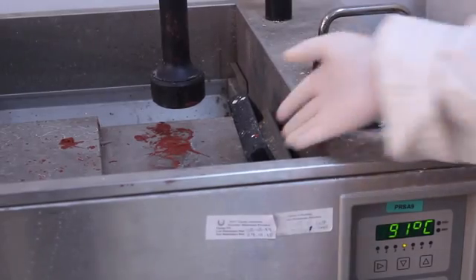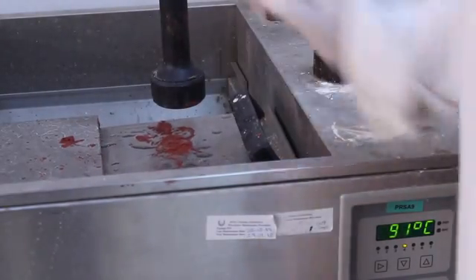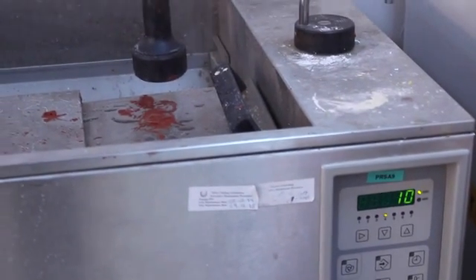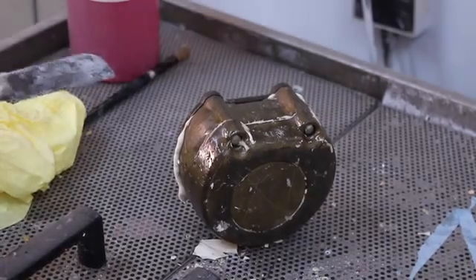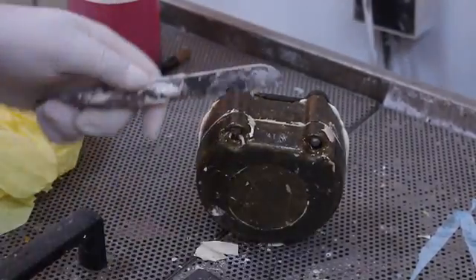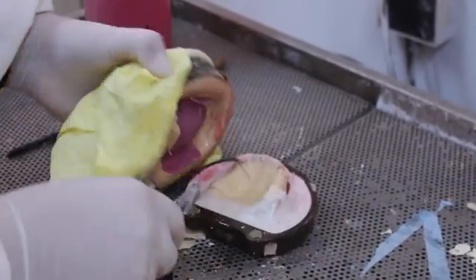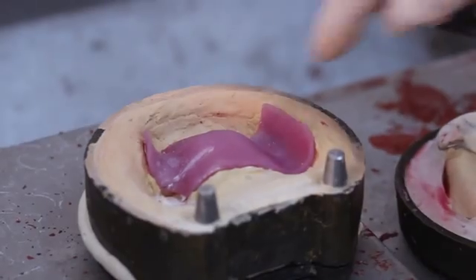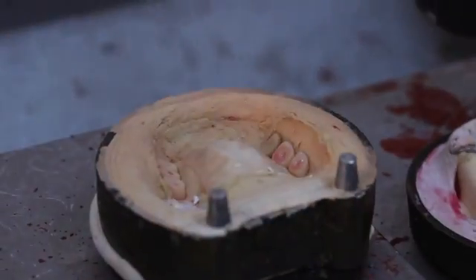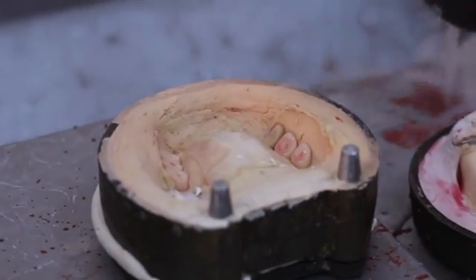The flask is placed in boiling water at 91 degrees Celsius for 10 minutes. Carefully remove the flask from the de-waxing machine and open the flask using a gypsum knife. The upper portion of the flask is lifted as vertically as possible to avoid fracturing of the investment layers. The softened wax and the temporary denture base are removed from the flask. Note that the clasps should stay attached to the abutment teeth. The remaining wax is flushed from the mold using boiling water.